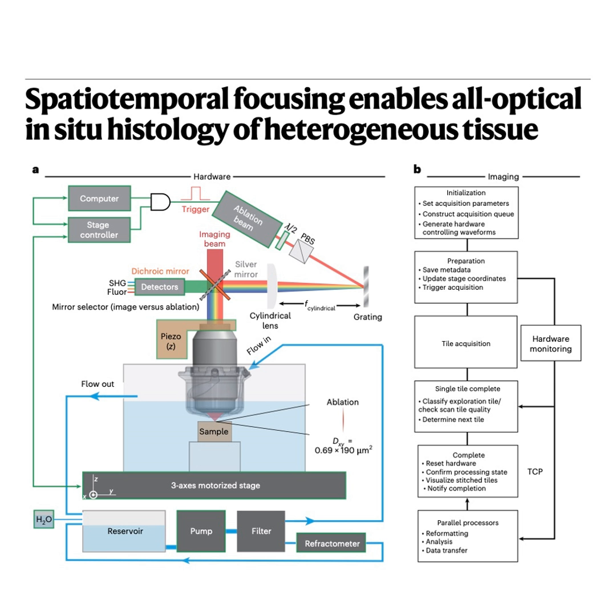Then comes ablate, which is the physical removal using the STF laser line focus. But even here, there's more intelligence. The system doesn't just raster scan the laser back and forth blindly. It has to plan the cutting path efficiently, right? Especially across a potentially large and complex shaped area for that layer. Exactly. It treats the required ablation path for that layer as a classic computer science puzzle. The traveling salesman problem, or TSP. The TSP. Finding the shortest route to visit a set of cities. How does that apply here?